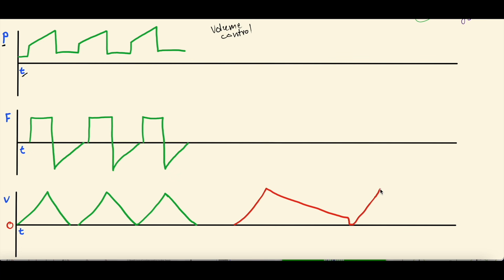And then you get another breath in, then they take a long time to breathe out. And that's related to different pathologies, which we'll get into more in a little bit. The flow scalar with AutoPEEP can also be a hint, right? Because you get flow in, then you get flow out, and then it returns to 0 before the next breath, because there should be a slight pause. There should be no flow, right? You get a breath in, breathe that out, pause, then another breath in. There should be a period where there's no flow in the circuit.